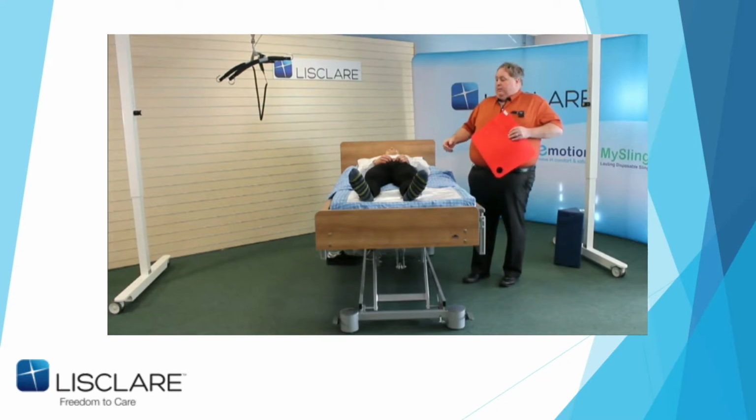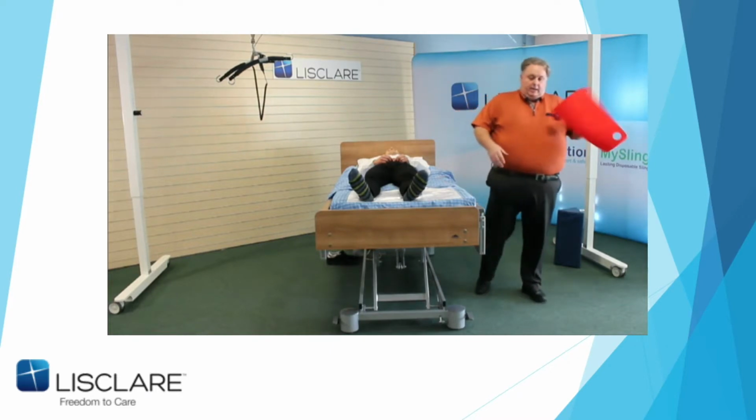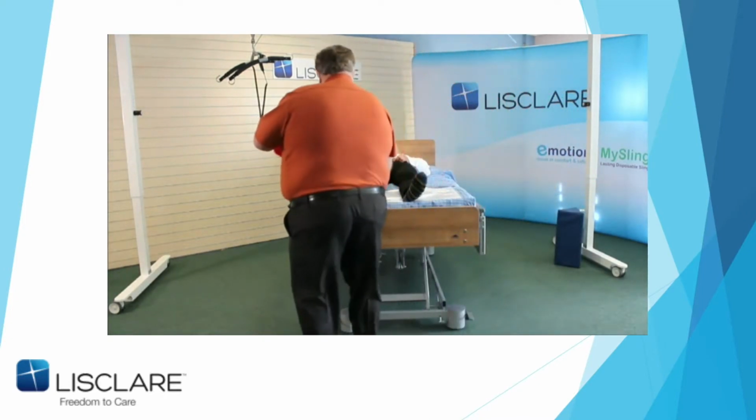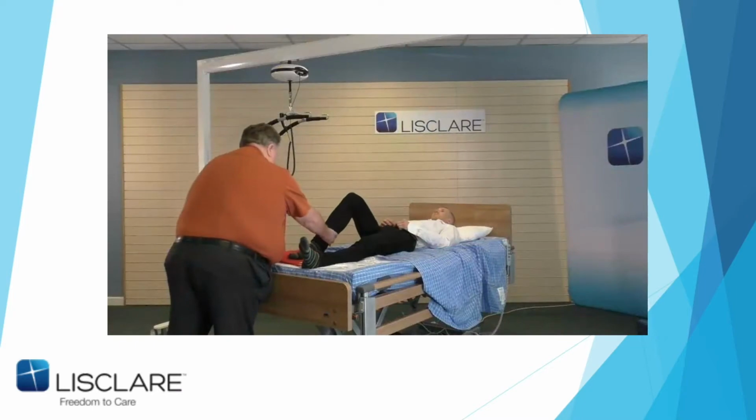John, we're going to describe as a positive active patient. So basically, he's got movement. Now, God forbid me saying this, but at this point in time, we'll say that he has left side paralysis, but has got good upper body strength down the right-hand side and can bend his knee. So this is the wee non-slip mat. I've used it for years. Sorry, I'm back to the camera, but bring John's leg up. Okay.